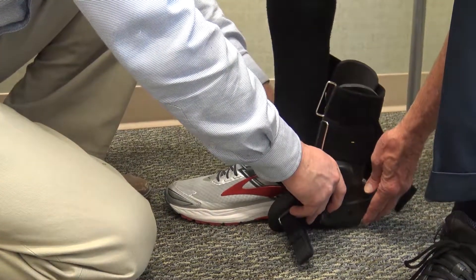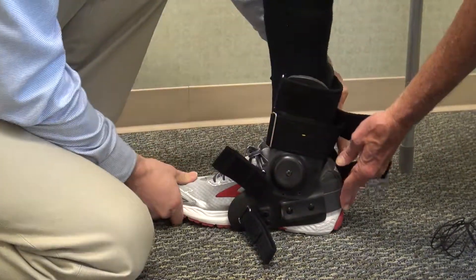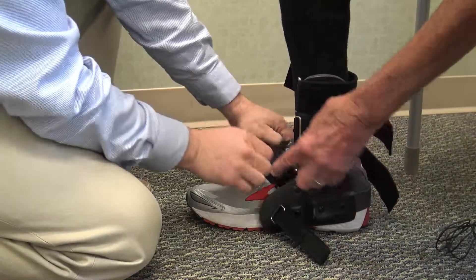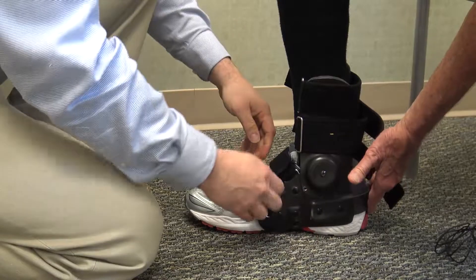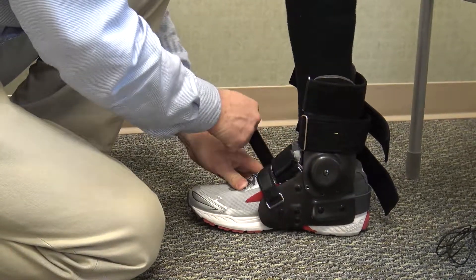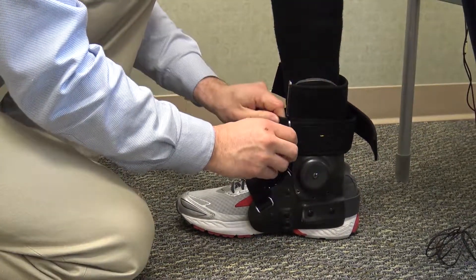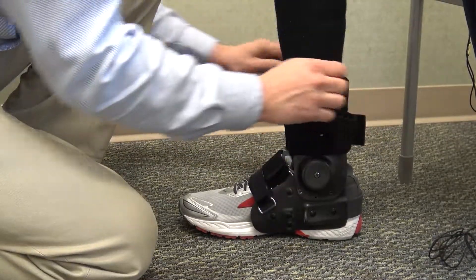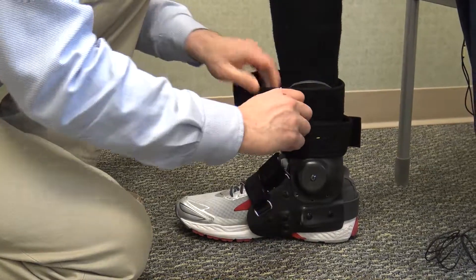Now he's going to put it back on. The most important thing — he's going to take his right hand and make sure you ram that in. Strap number one is right over the ankle. See how he put it on with his hand behind there? Here's number two, number three, and number four. The first time may be a little frustrating, but after you get the hang of it, it works very well.